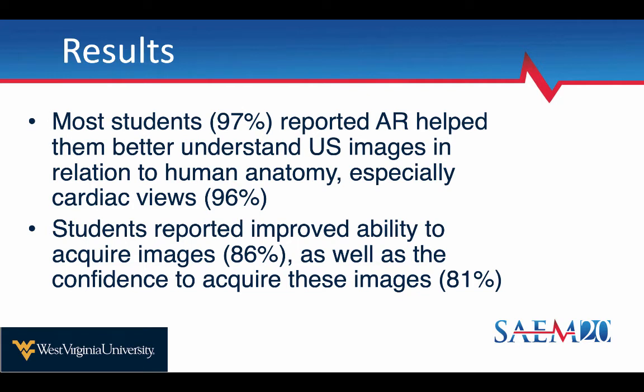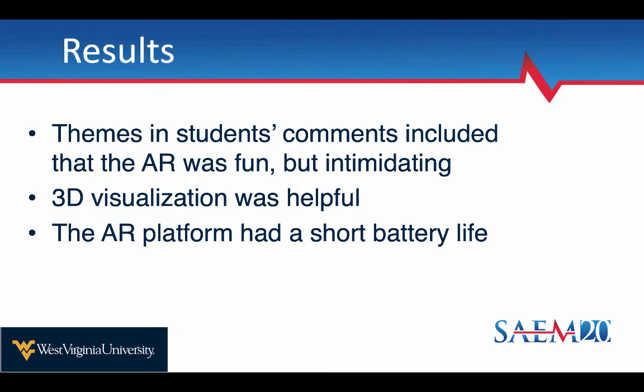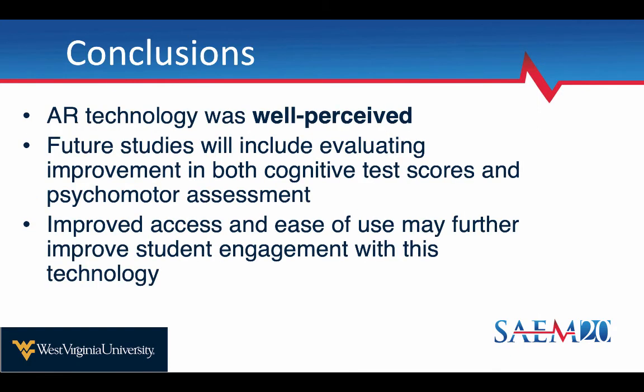And it shows the value that they felt this was important for them. The students reported that the AR, even the ones who didn't come to class, so this includes them as well, helped them better understand the images in relation to human anatomy, especially the cardiac views. They thought that it helped them acquire images and gave them more confidence in acquiring those images. We also had them give comments, and the general themes were that it was fun, but they did find it a little bit intimidating. They loved being able to real-time 3D visualize the anatomy, and there were multiple comments about the short battery life of the headsets.